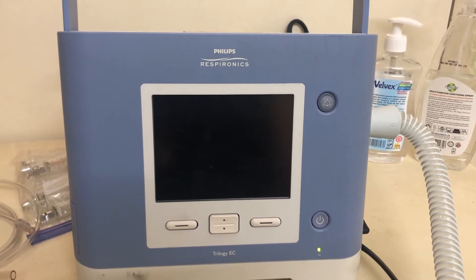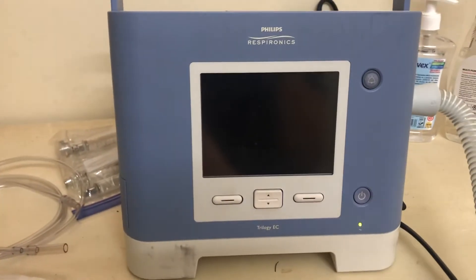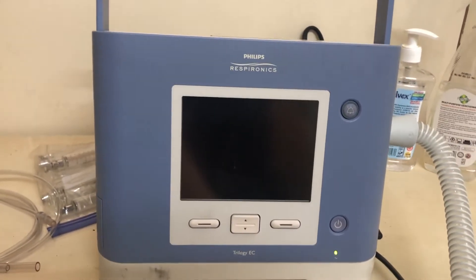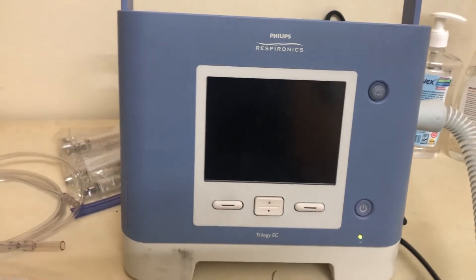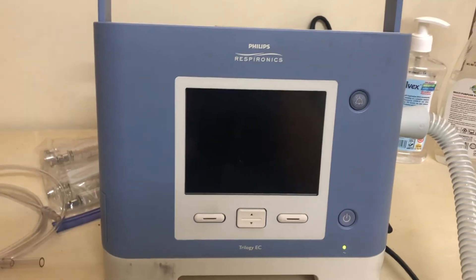We got some new machines called the Trilogy EC by Philips. These machines are for home use, BiPAP use, or low-acuity patients. Our biggest use is going to be for BiPAP or low-acuity patient transports.